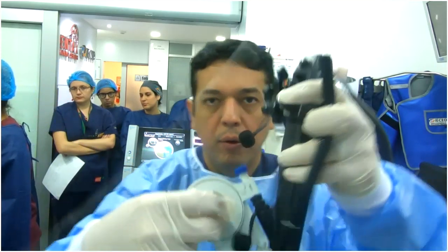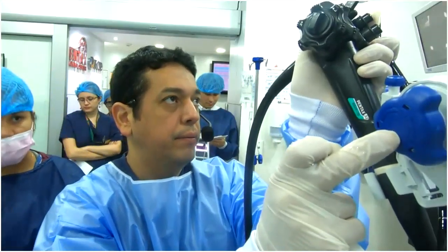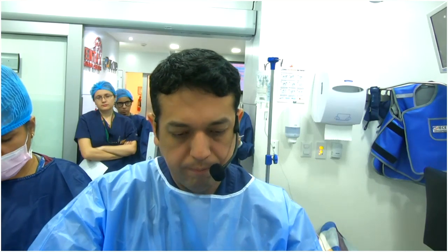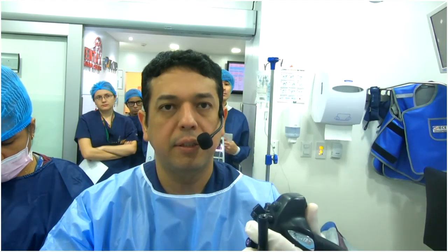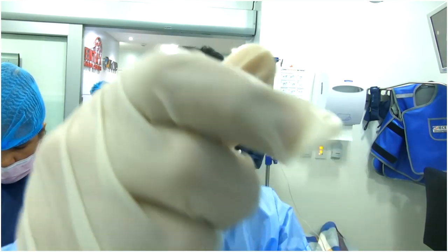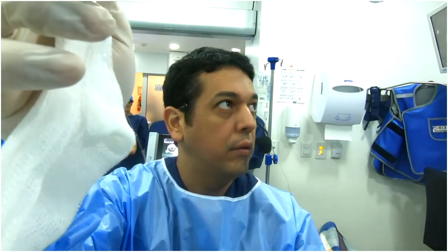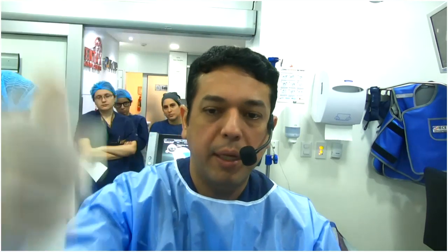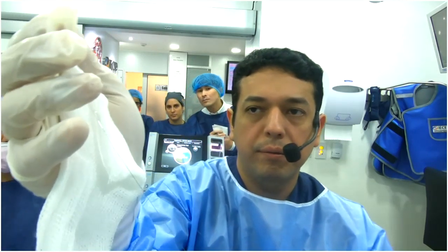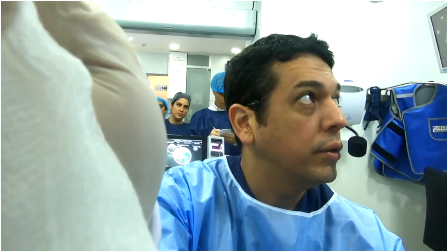And then we have this area and we have the blue area. So we need to adjust here the distance of this metallic area. You can see? Okay.